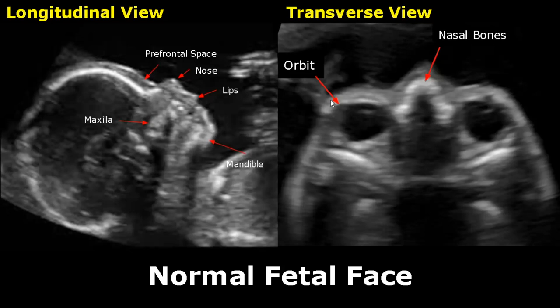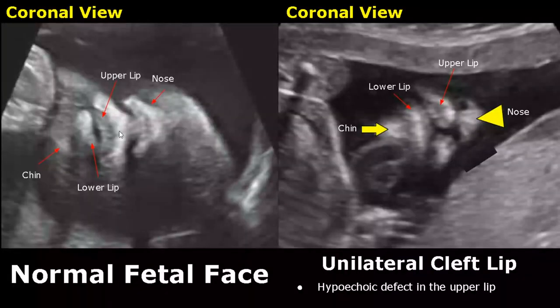The transverse view can be used to view the eyes — these are the orbits. These small structures are the lenses, and these hyperechoic structures are nasal bones. Here is a coronal view in which we can see the nose very clearly, and also the upper and lower lips. This small hyperechoic area is the chin.